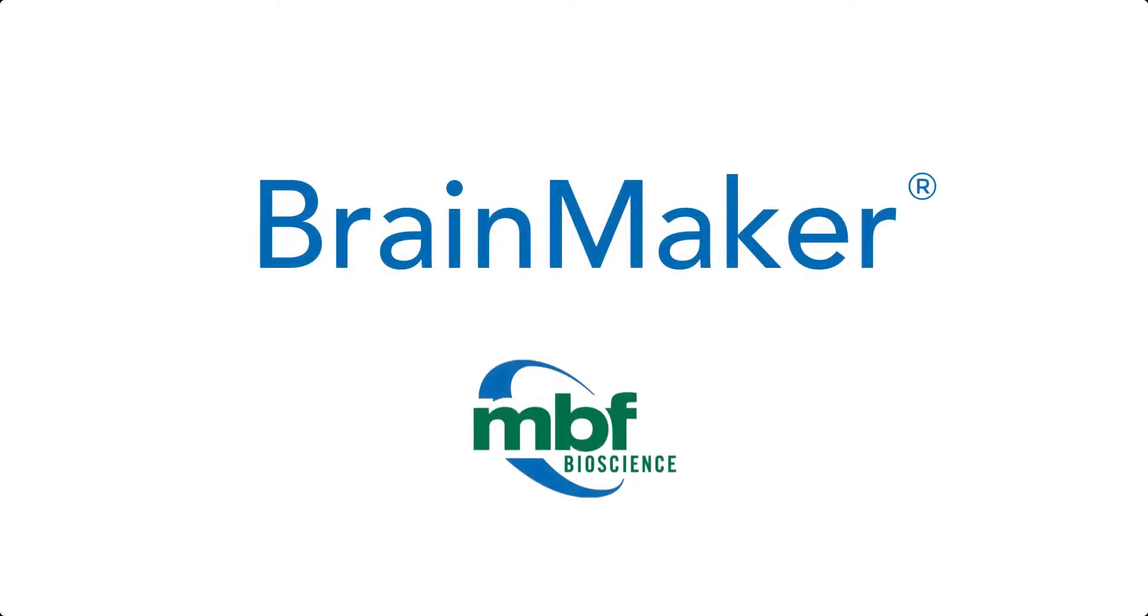BrainMaker automatically creates full resolution 3D reconstructions of entire organs from serial sections of whole slide images. It allows you to easily view cells, structures, and lesions. Let's show you how it works.